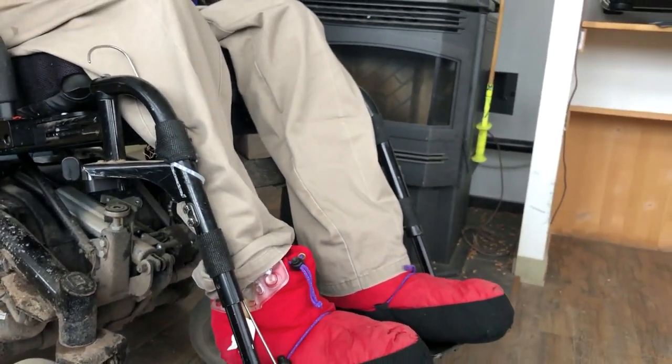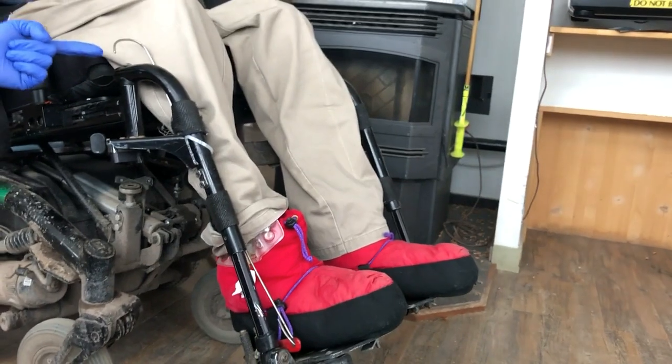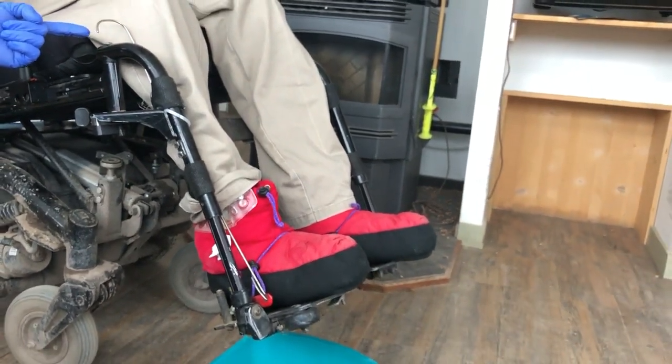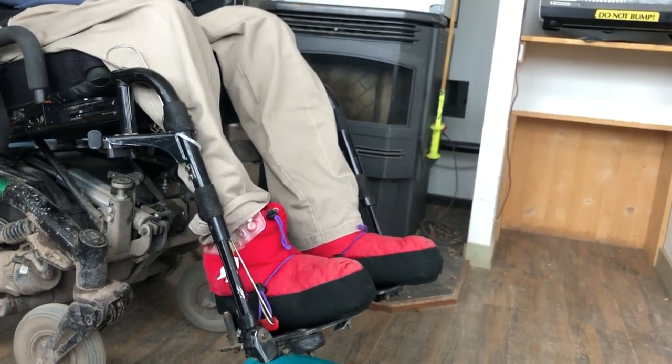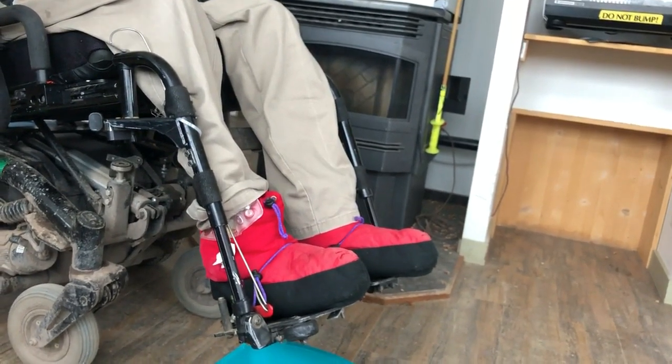I've stuck another 180 degree bend in it, wide enough that I can get my hand onto it and go like this. So I just lift up, and then I can push down, and that opens and closes it. And that works for me, but maybe not for everybody.